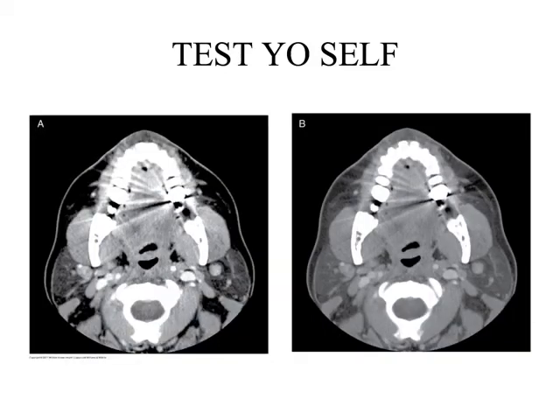All right, on this image, what have we done? Have we changed the window width or the window level? Is it the level? Because the left one is sharper than the right, but they have the same amount of gray? That's a really good way to think about it, but no. This is still a window width change.